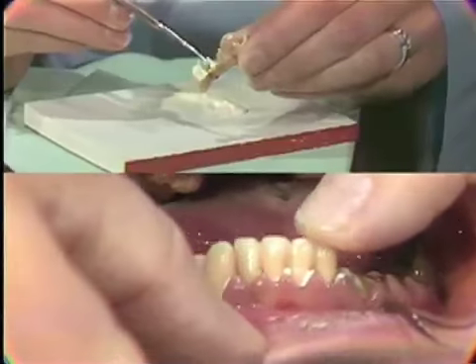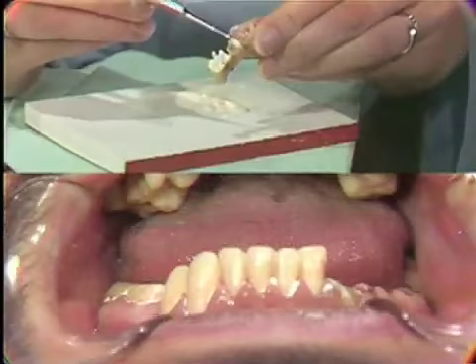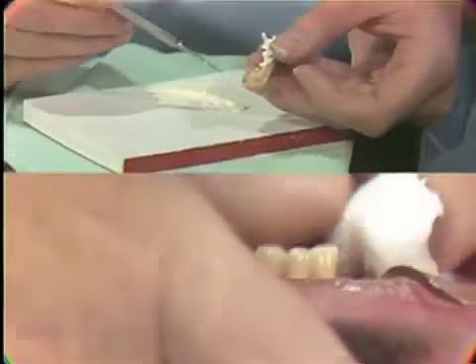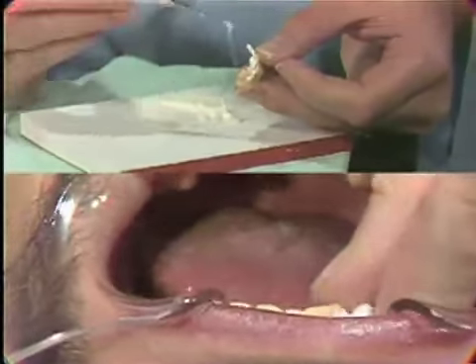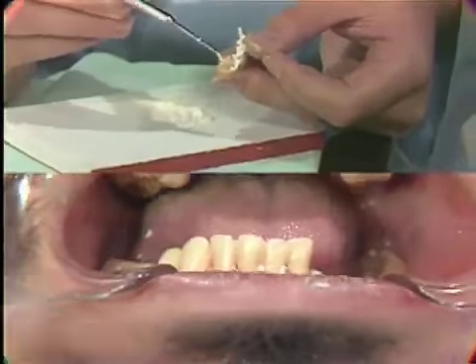It's good to be able to see the cement coming around the margins. If you don't see the cement coming out around the margin of the restoration, you might not have a good seal. If you don't have a good seal on the temporary, you could create a sensitive tooth.